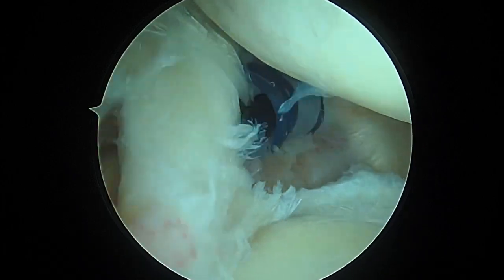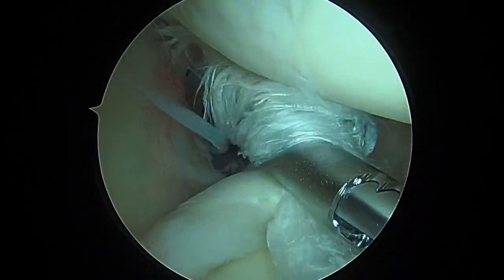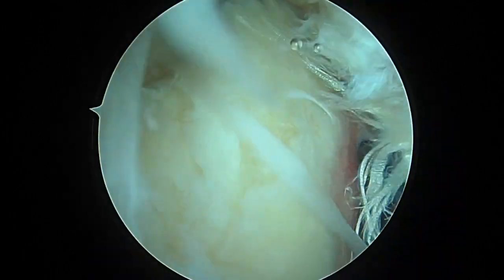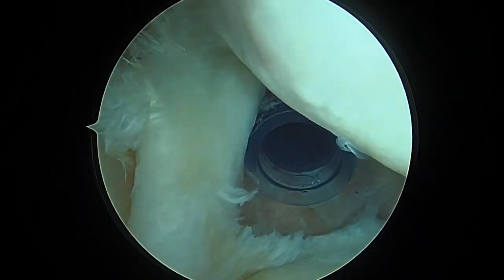Here's the biceps — as I tug on it, that's the biceps — and you can see all that tearing is actually part of the biceps. Then to the left of that there's a hole here; that's the rotator cuff tear. So the next step for us is to secure the biceps. We'll take a spinal needle first.